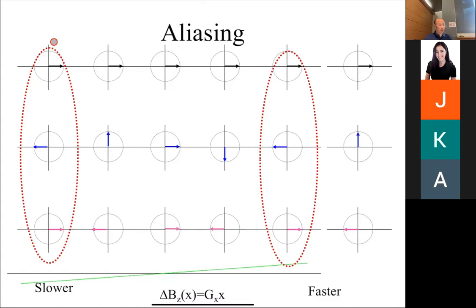So what could I do to solve that problem? Obviously this spin is going this way, and this one is going this way. But at this time step, at these locations, I can't tell. This spin went this way and this spin went that way, but because of the step I took, I can't tell. I can't differentiate pi from minus pi, right? So what could I do? If you were the MRI engineer or physicist, what would you recommend? Yes, take smaller steps. Yeah, take smaller steps, right?